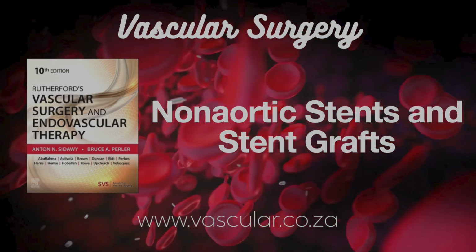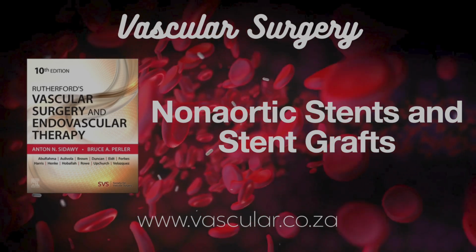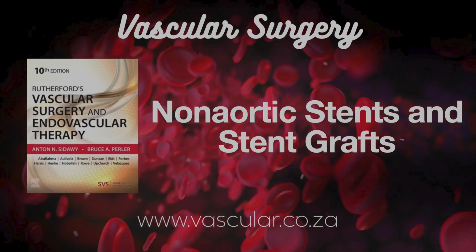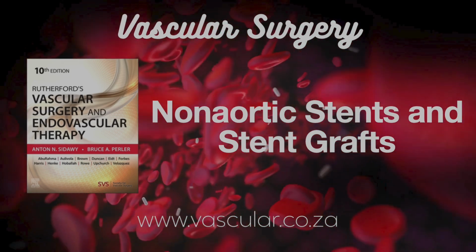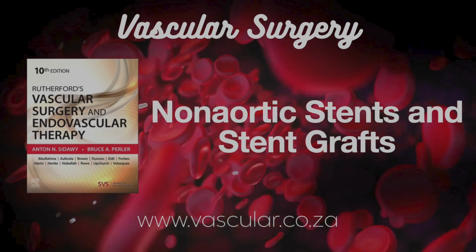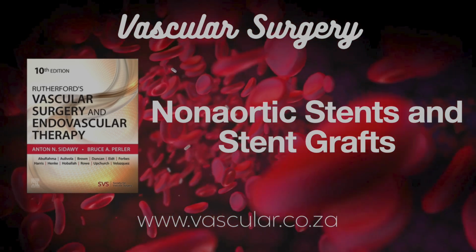Studies, like the COBEST trial mentioned in the chapter, suggest covered BE stents might last longer than bare metal ones here, especially for tougher blockages. BE or SE in the iliacs generally? It varies. BE often for short blockages, SE for longer ones, especially if they go down into the external iliac artery, which tends to be more twisty.